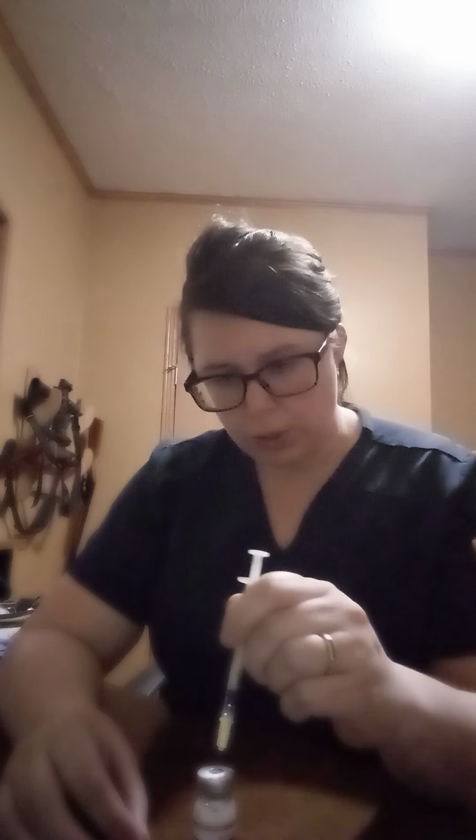Okay, once I've verified that I have 0.1 milliliters of medication in my syringe, I'm going to recap my syringe because I have to walk to the patient's room. So for that, I'm going to demonstrate for you the scoop technique. Hopefully you can see that. I'm just going to scoop with one hand the cap onto the syringe, and then I can use the other hand to firmly push it down.